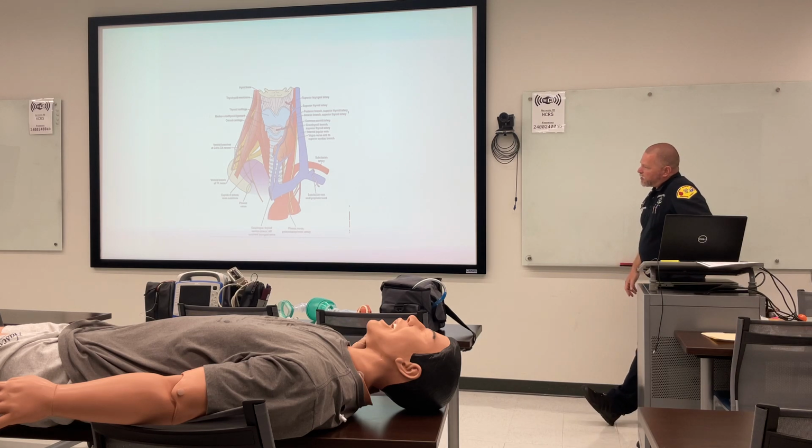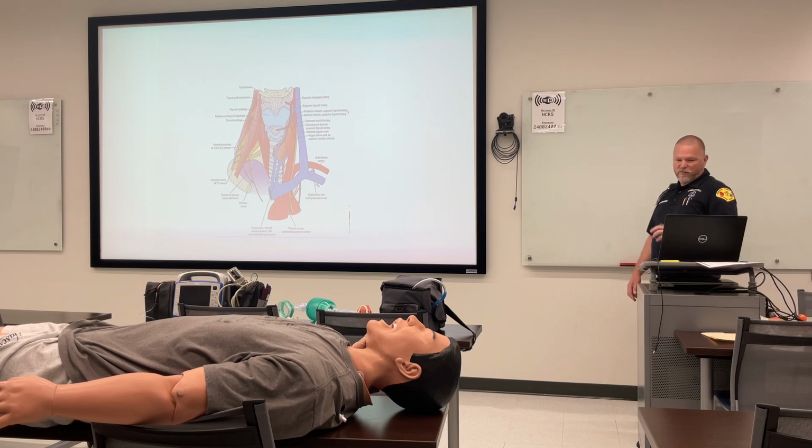Due to the anatomy and where it's located, it can be a bloody procedure. You can just expect it. So we're going to prepare for that when we prepare our equipment. You can cause some trauma, but for the most part, the area that we're dealing with gets us away from most of the anatomy that you can do damage to. It can cause complications if you get a little overzealous with some of your cuts.